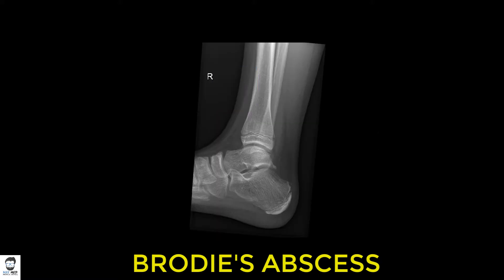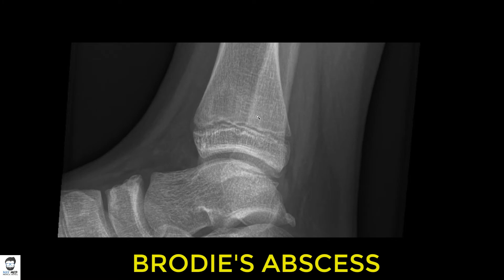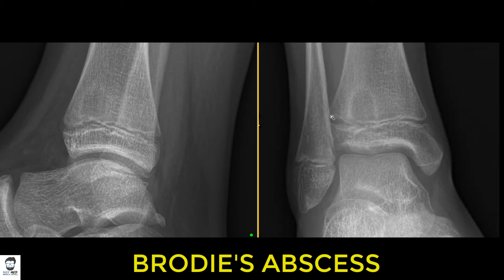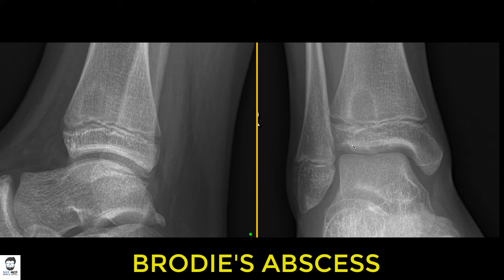On the lateral view of the ankle, you can similarly see that well-defined lesion, just reaching the growth plate of the tibia, but no other major changes are seen. When you need to rule out certain conditions, MRI is always a good option and the best choice for better diagnosis and assessment of these kinds of lesions.